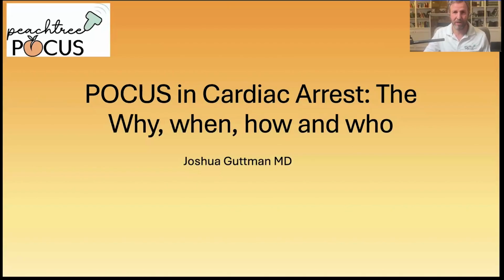So ultrasound has been used in cardiac arrest for quite a while. At first, the focus was mainly on prognostication, meaning trying to predict who was more likely to achieve return of spontaneous circulation and meaningful survival. But since then, its role has grown well beyond that. And by the end of this talk, you'll walk away with a clear, practical framework for when and how to use POCUS during cardiac arrest. So the very next time you're at the bedside with a patient in cardiac arrest, you know exactly how to apply it.